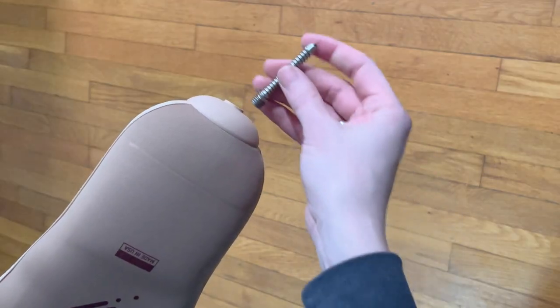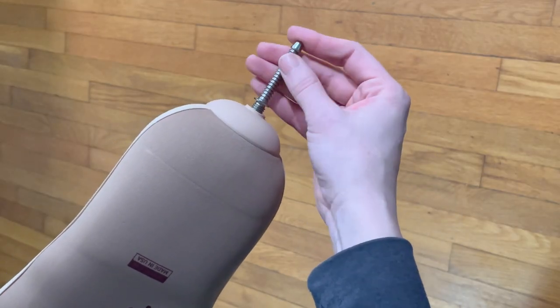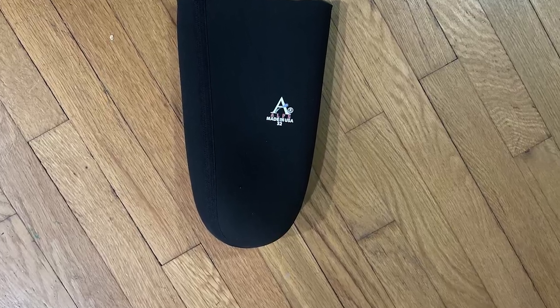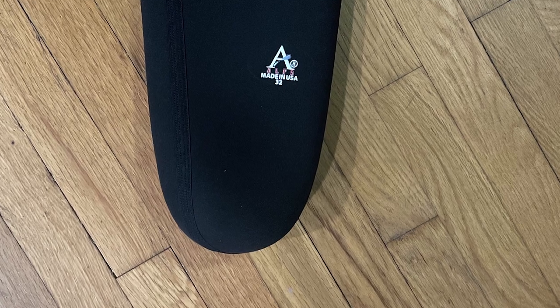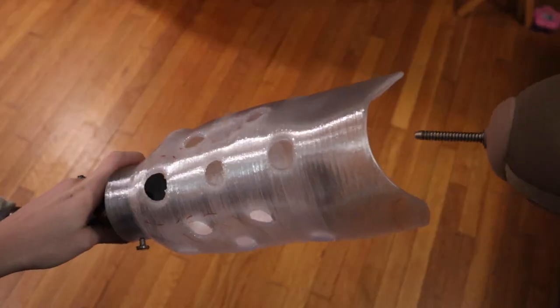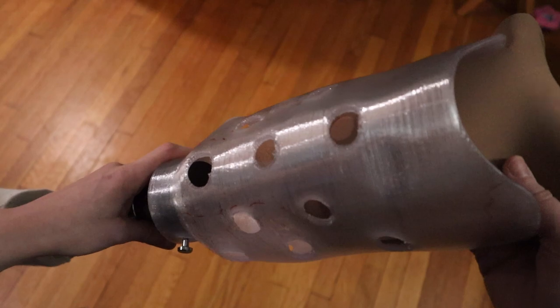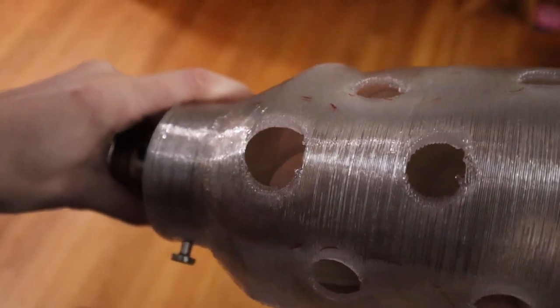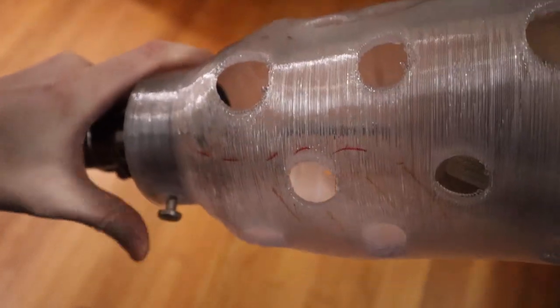What we are talking about today and comparing are two ways for a prosthesis to stay on the limb for someone with a transtibial or below knee amputation. With either system, you're going to start with a liner. For pin suspension, the liner is going to have a distal umbrella that a pin screws into. For sleeve suspension, the liner is just going to have a round cushion bottom with no distal umbrella. For pin suspension, the pin clicks into a lock built into the socket. You then push the release button to remove the prosthesis.